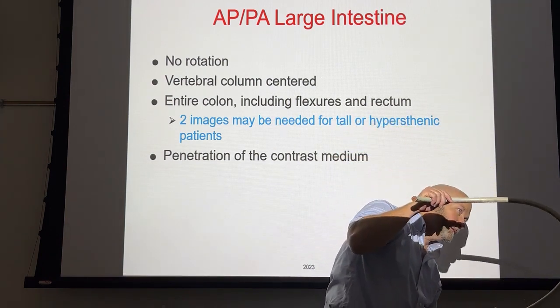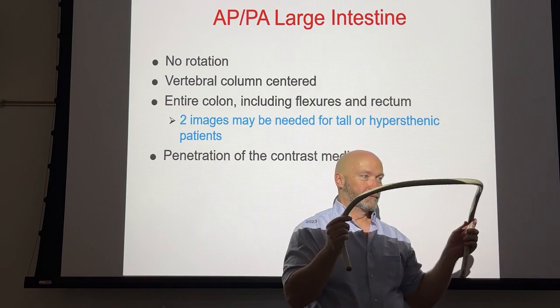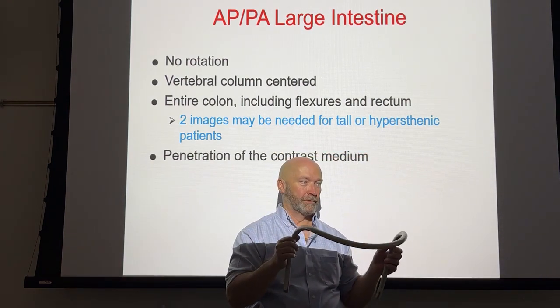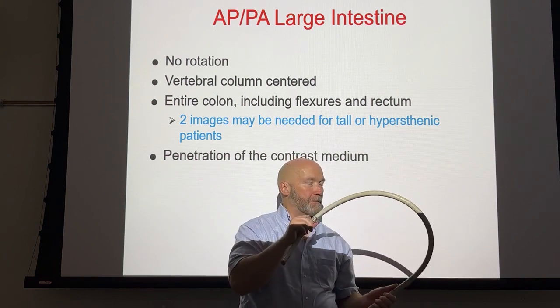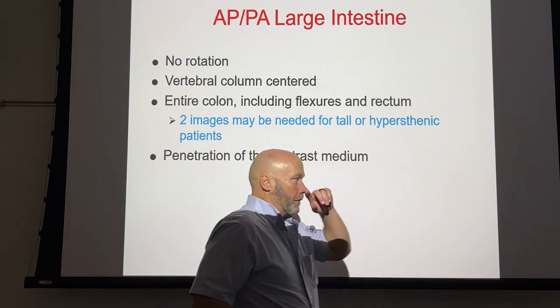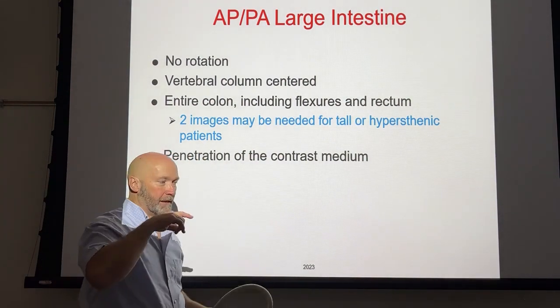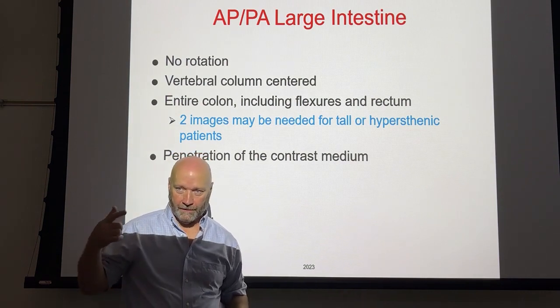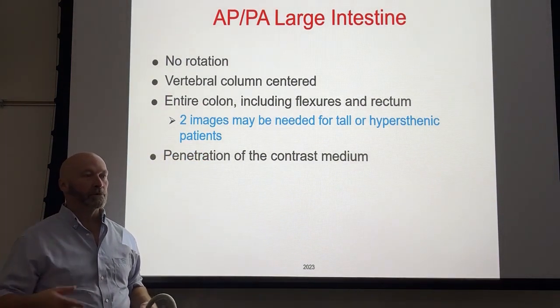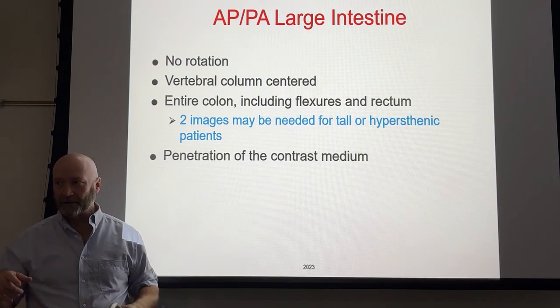Just kind of lean, you know, while you're taking the test. Just lean and kind of try to figure it out, right? Most complicated portion of the test is where's the barium going to be on your decubitus. So most complicated portion of the exam is also going to be that. All right, so where you could get away with making the patient make a single rotation for your solid column, the patient's pretty much going to have to turn over twice for your air contrast.